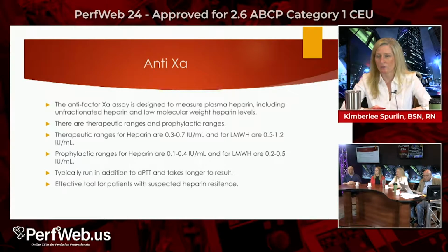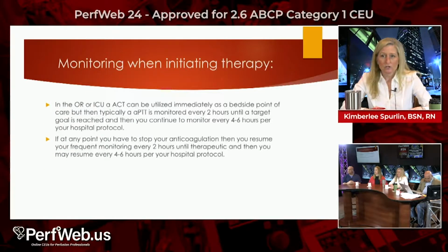We have a wonderful clinical pharmacist that works in the unit who is much more familiar with this dosing and the literature, and really gives us a hand with that. It's typically run, again, in addition to APTT, but it takes longer to result. Effective tool for patients with suspected heparin resistance. Monitoring when initiating therapy, again, in the OR or ICU, an ACT can be utilized immediately as a bedside point of care, but then typically we transition back over to the PTT.